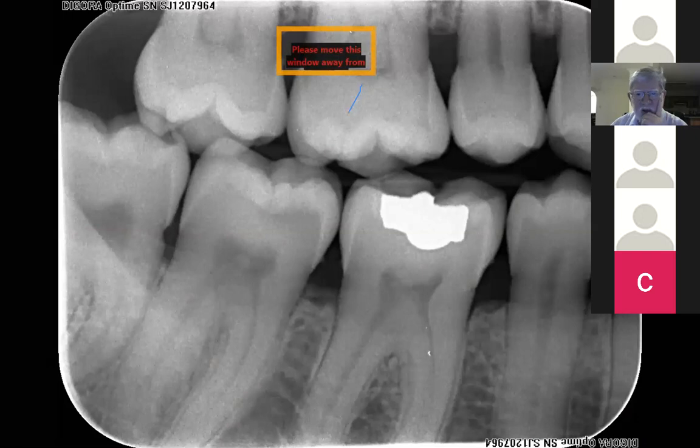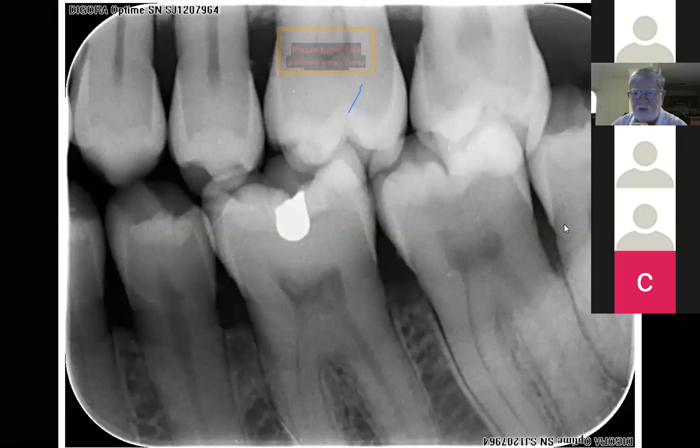Going back to this same patient, we talked to her about caries that she had there. We talked to her about the early chronic periodontitis that she had. All she was concerned about is me talking to her about her wisdom teeth. We sent her off for an OPG because all she was interested in was having her wisdom teeth removed.